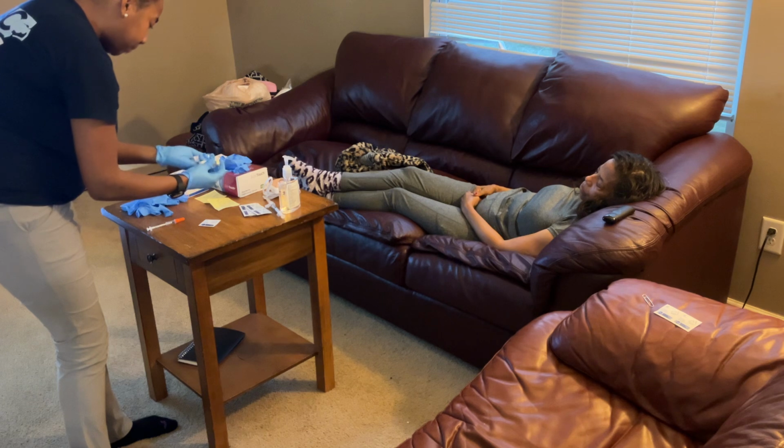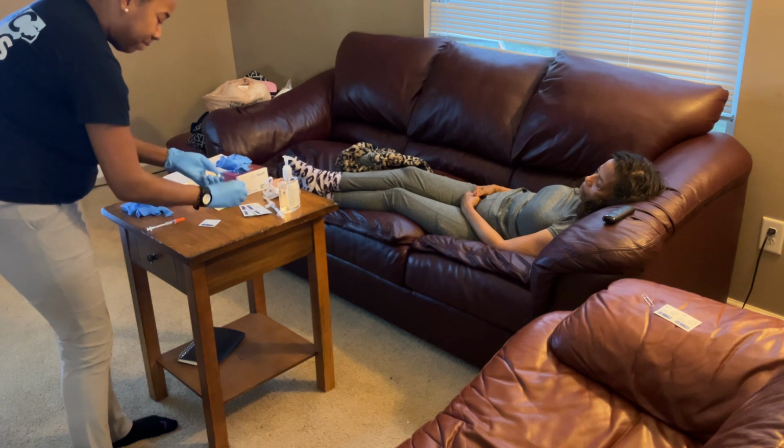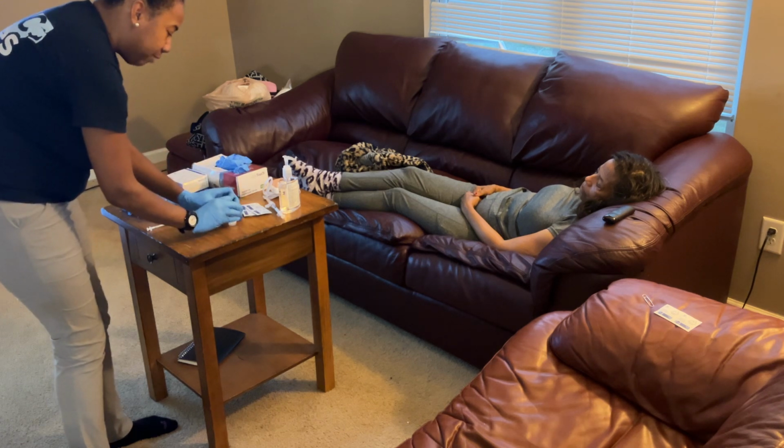Once more, Charlene Allen, 5 units regular insulin, 5 units of NPH to be administered now, subcutaneously. The time, to be documented later. And this is for diabetes management to control glucose levels.